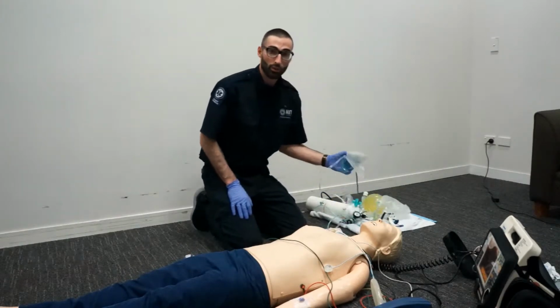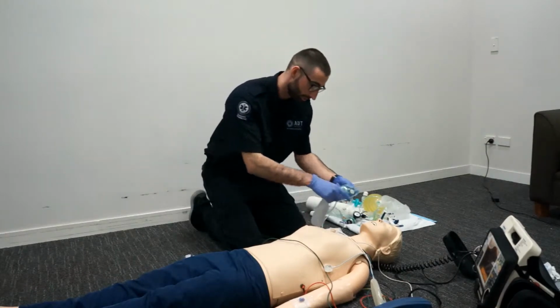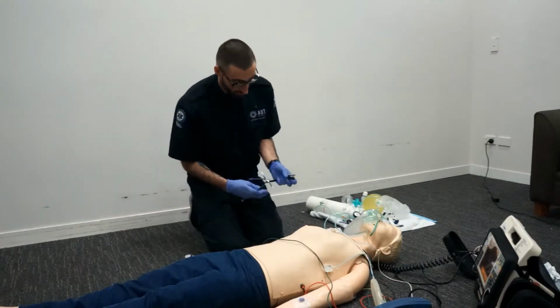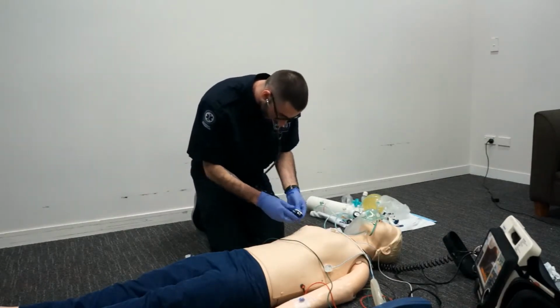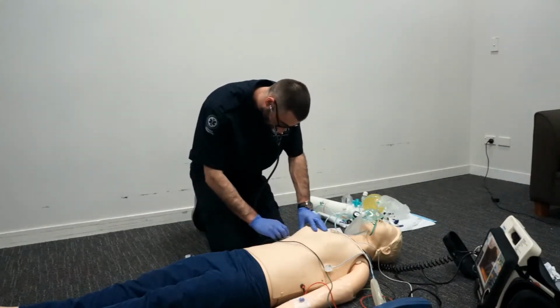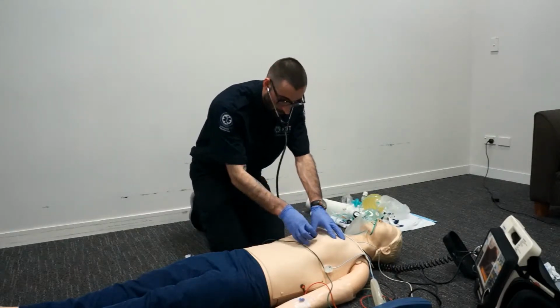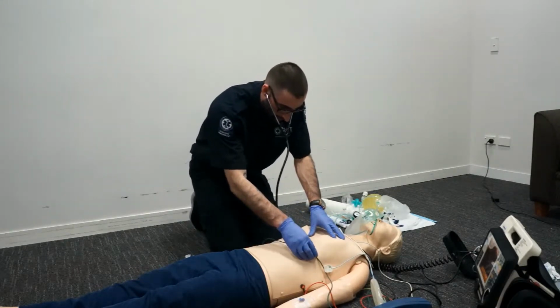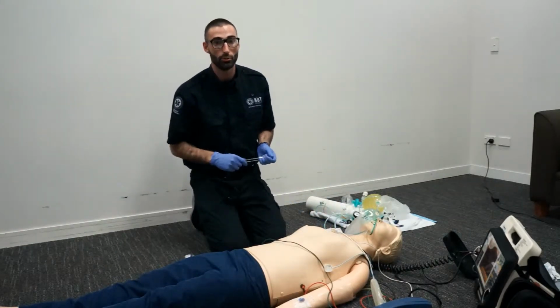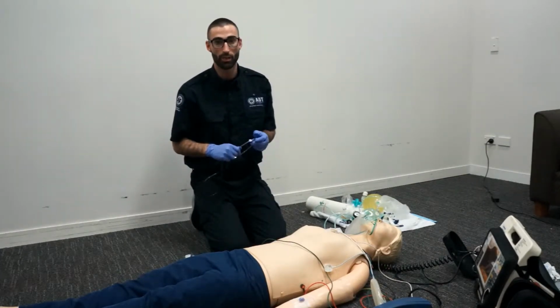With this information, we're going to attach high flow oxygen with a reservoir mask at 10 litres per minute. And I'm going to go ahead and listen to his lungs. Upon auscultation, it was noted that Steve had widespread crackles. This is indicative of cardiogenic pulmonary edema.